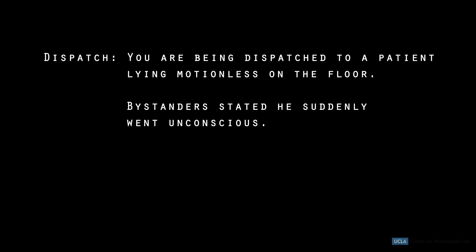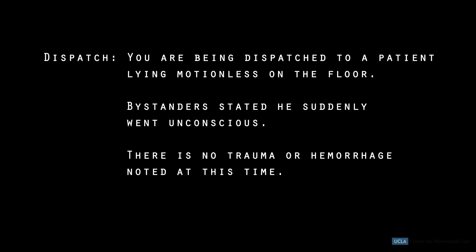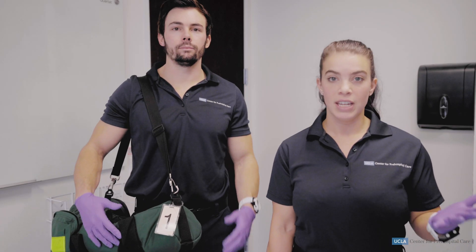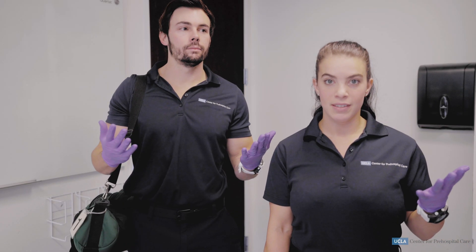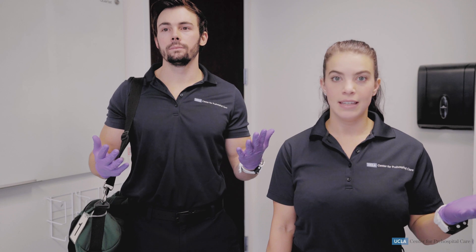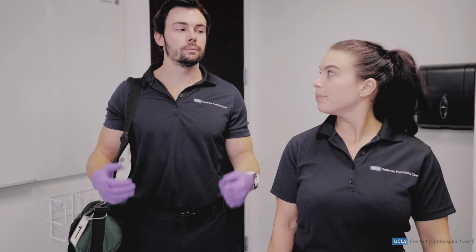You are being dispatched to a patient lying motionless on the floor. Bystanders stated he suddenly went unconscious. There is no trauma or hemorrhage noted at this time. I've taken body substance isolation and I do not see any scene hazards.